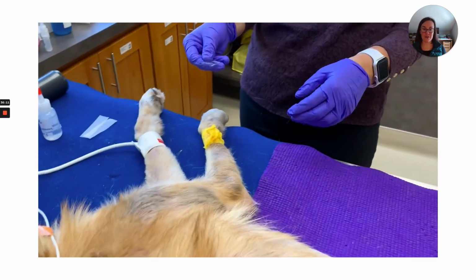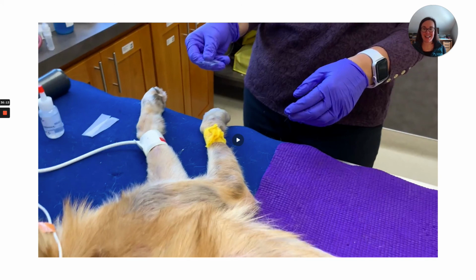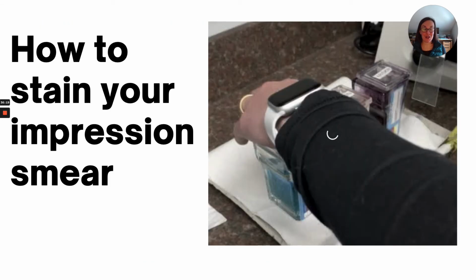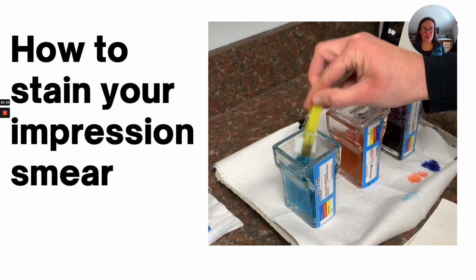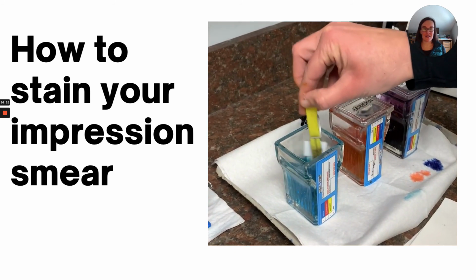So this was a nightmare case in San Francisco. Immunocompromised dog with generalized M. canis. Anywho. So impression smear. Now you get your impression smear sample. How are you going to stain it? I use my little clothespins. Obviously this needs a fixative.